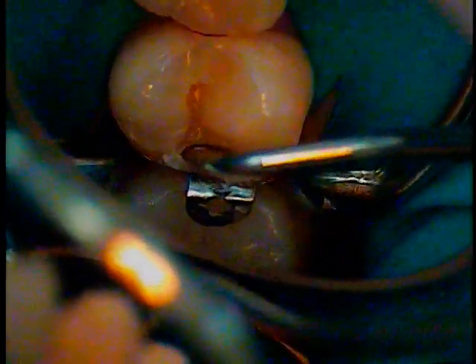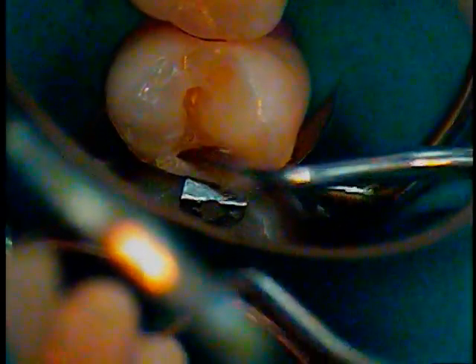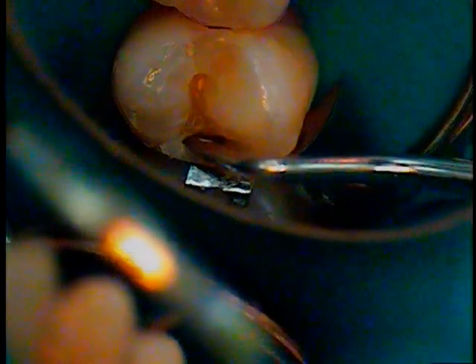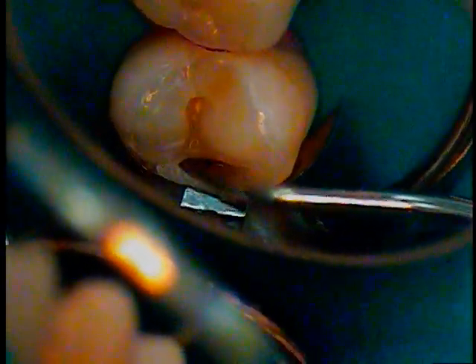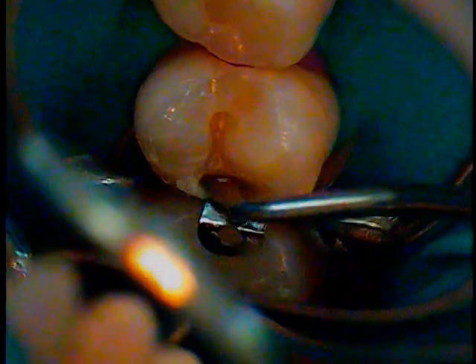As much as you can. Now I'm just going to use the condenser just to go back in there, kind of tidy things up a little bit. You okay underneath? Okay. Again, I'm just building the wall a little bit, so taking my time because it's a video, but I got to do it. I'm going to cure that again.